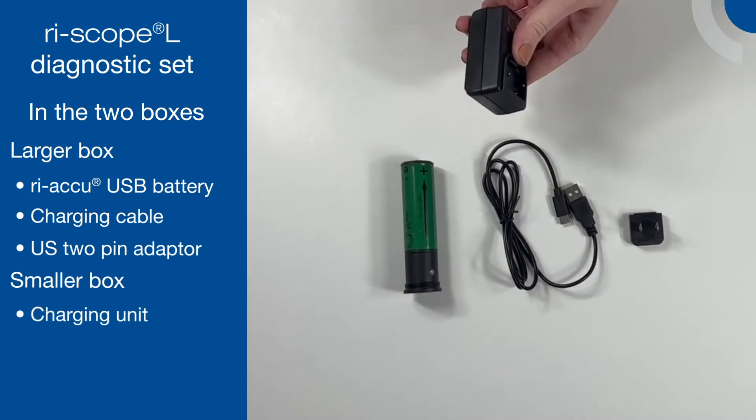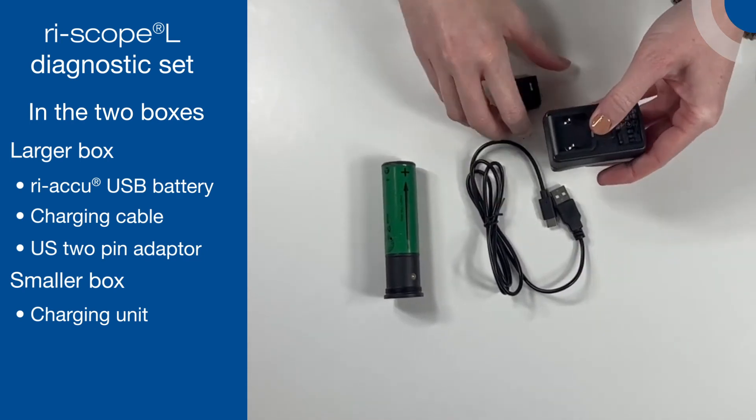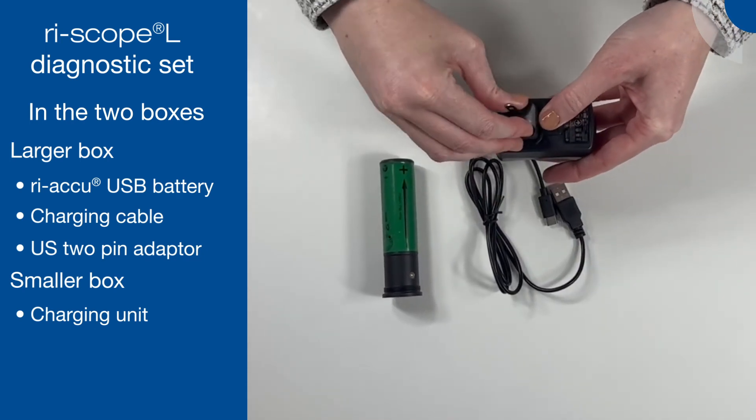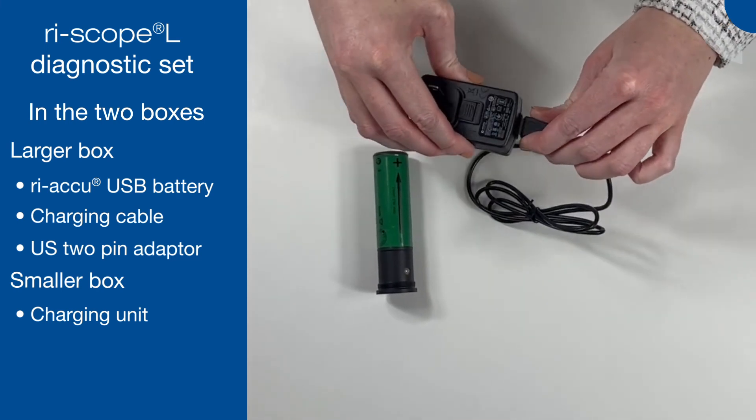Attach the US 2-pin adapter to the charging unit by pushing the button down on this unit and sliding the pin adapter into place. Release this button once it is in place to secure the attachment.